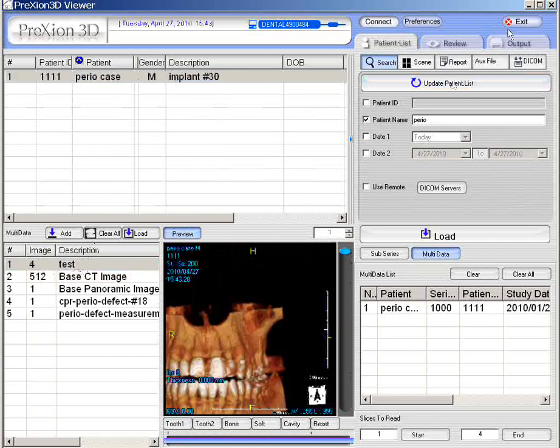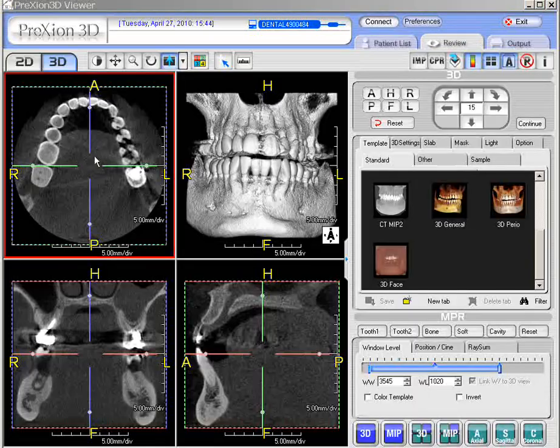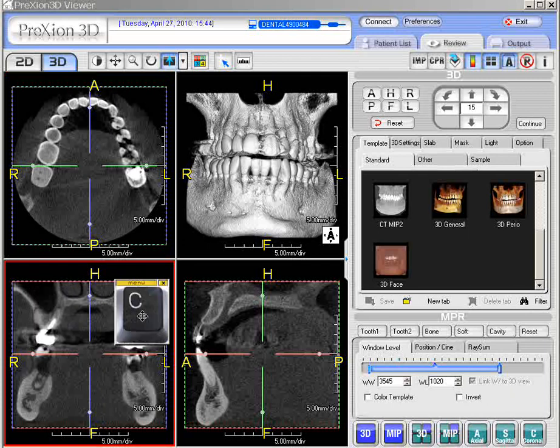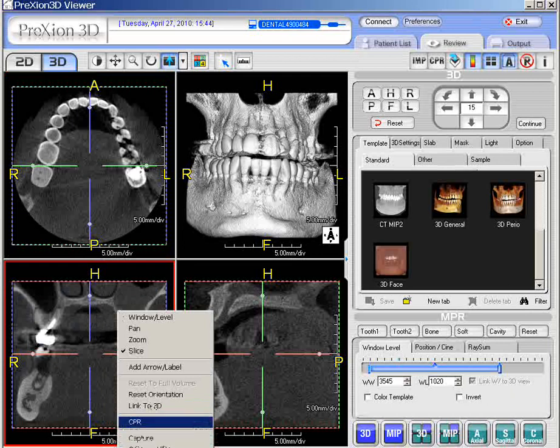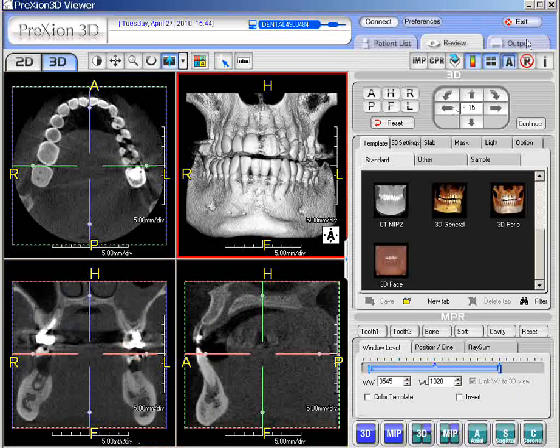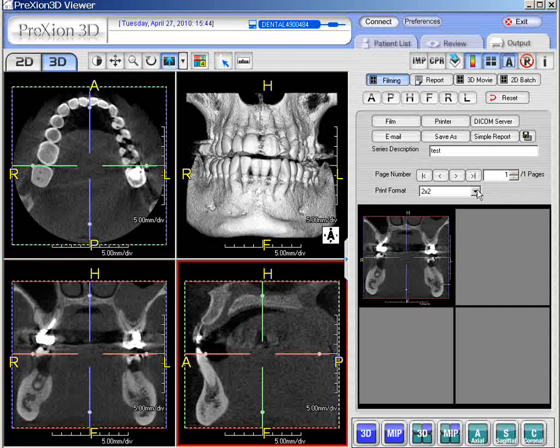Most of the time when you're in the output panel, it's so that you can print or email. So that's how you do it — either C on the keyboard, or Capture, or right-click and Capture as well. From this screen, the letter C for Capture pressed quickly, or right-click and Capture or Capture All Views. Once you do that, you must go to Capture first, then Output Panel, and from the Output Panel you have your functions on what to do. That's a quick way of capturing and saving.